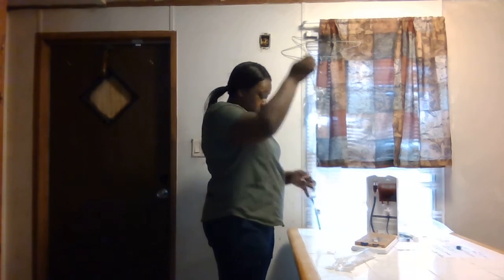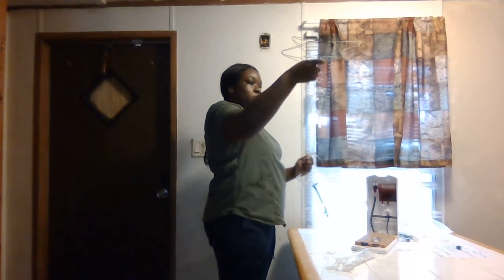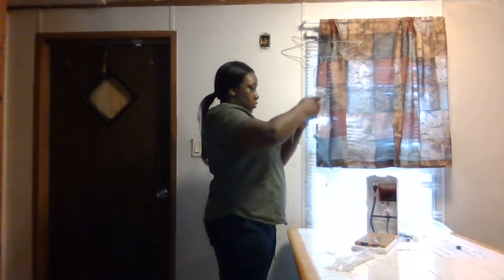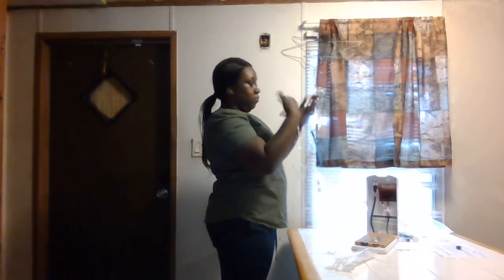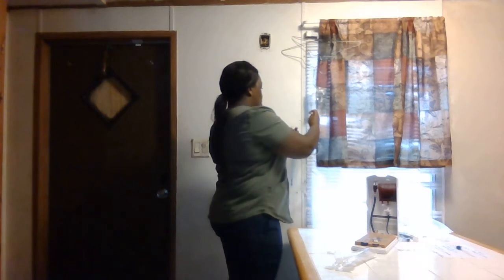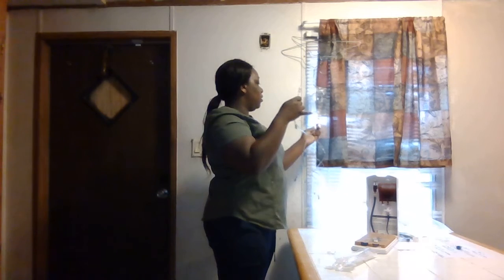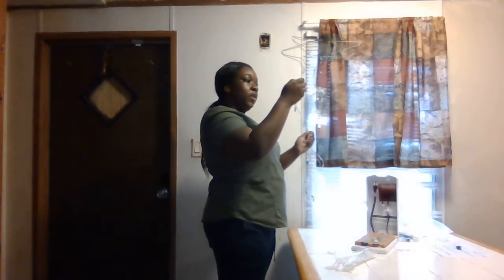Run it. And here it goes. And again, we're checking for air bubbles. If we have any air bubbles, we can give it a thump, thump, thump. Or use your pen and thump it as so. Okay. And again, you know it's going when in the drip chamber you can see drops. Okay, so now I'm at the end, and we're kind of good to go. We don't have any air bubbles.